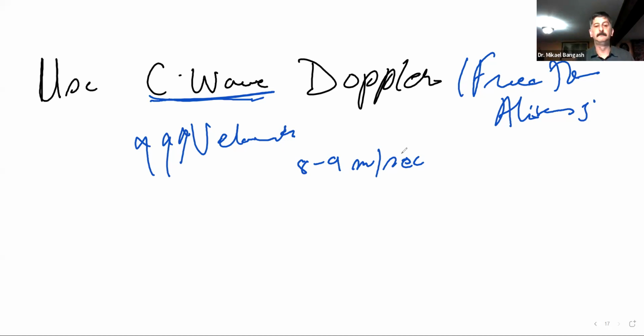If that makes sense. So actually, it's okay to go from pulsed wave Doppler mode to continuous wave Doppler.